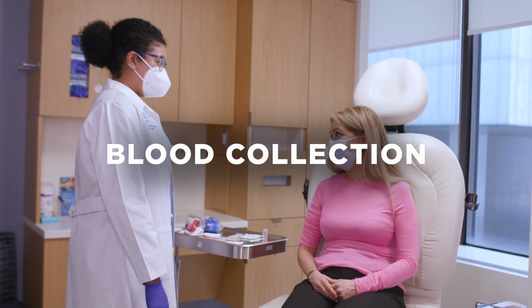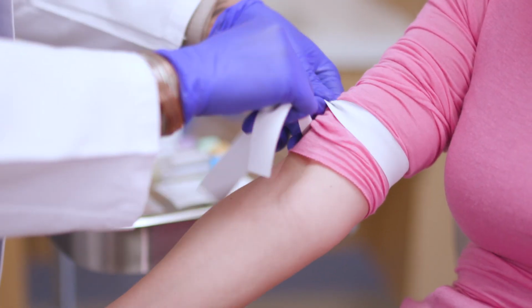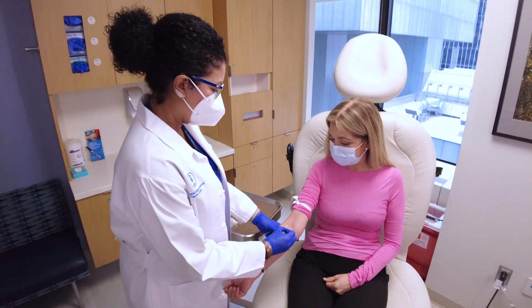Hi, my name is April. I'll be drawing your blood today. Is your right arm okay to use? Yes. Perfect. The research blood sample is drawn at the clinic by a phlebotomist working with the clinical team of the study.